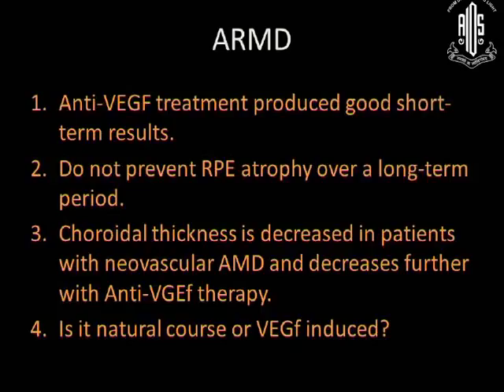A very interesting study has shown that choroidal thickness is decreased in patients with neovascular AMD and decreases further with anti-VEGF therapy. So if you are monitoring these patients on enhanced depth OCT and you realize that the choroid is undergoing atrophy, maybe it is time to talk to that old man that, okay, I am giving you the injection, I might be reducing your fluid, but probably you may not gain much.